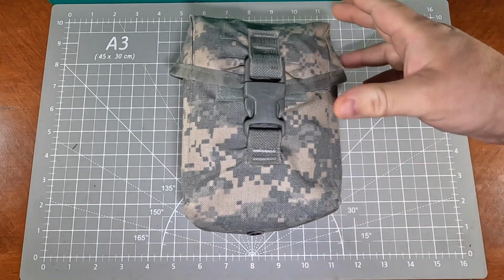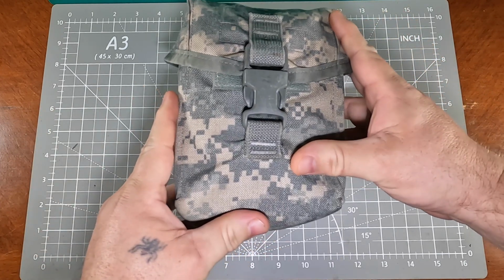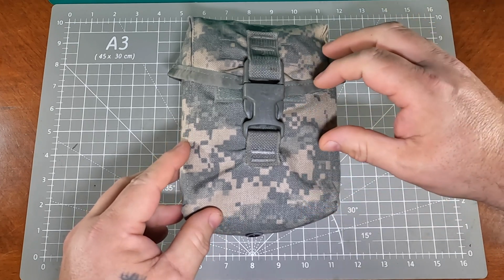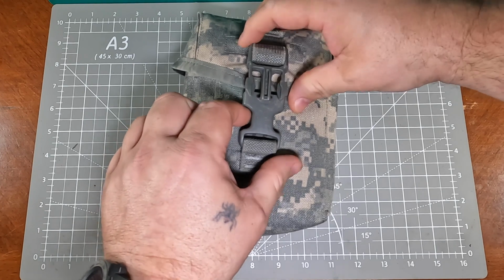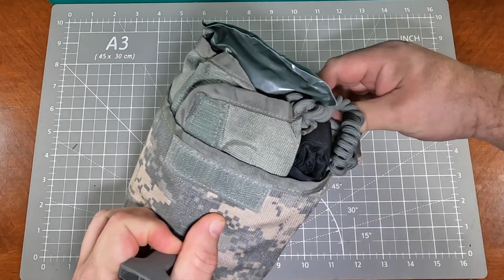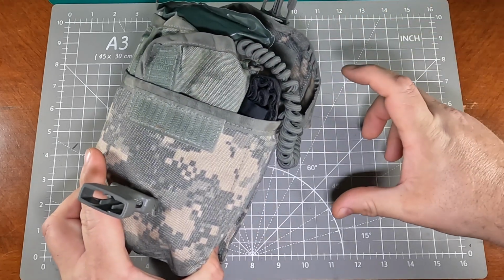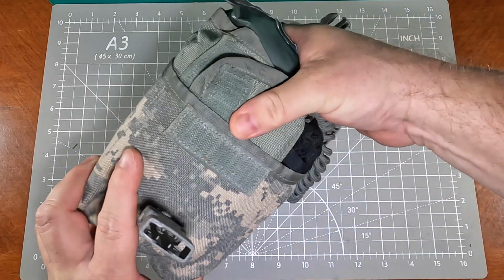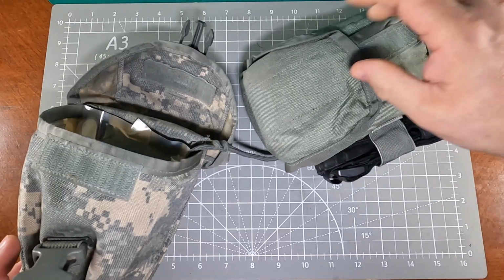Alright, so this is the pouch I actually used in Iraq. Probably last time I used it was probably 2008. The only thing that's missing in here, I guess, is going to be some lubrication for the nasopharyngeal tube thing. But inside the individual first aid kit, the pouch contains a lot of neat stuff. It also had a cutter that came with it, but it's separate. It's not part of the kit here, but it's an additional item that kind of went with the first aid kit. But inside it kind of came with some stuff.